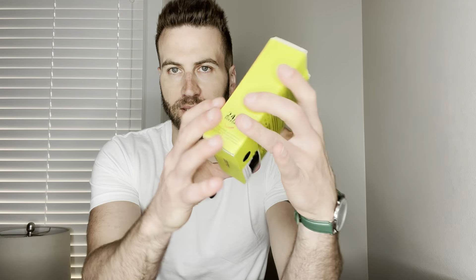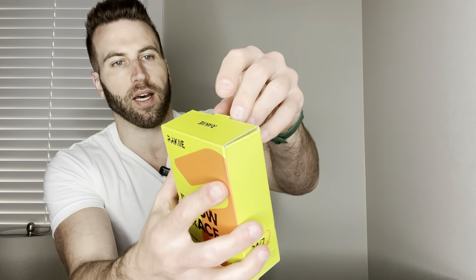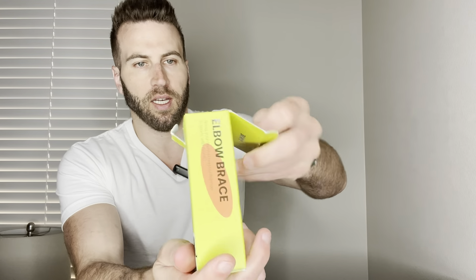I've got these RAKIIE elbow braces — it's a two pack right here. It comes in this nice little case. Let's go ahead and give you a quick unboxing experience so you can know what you're getting before you get it.